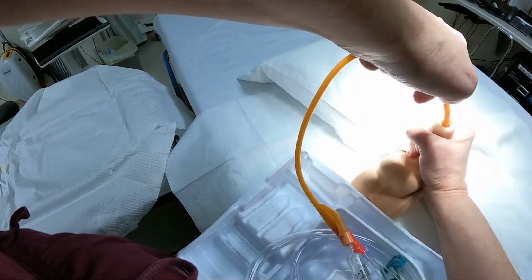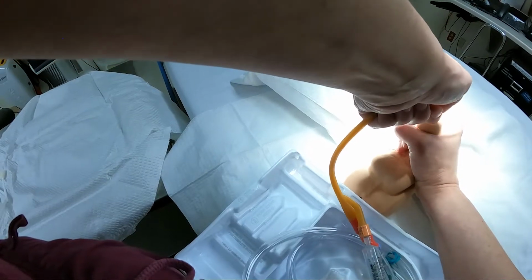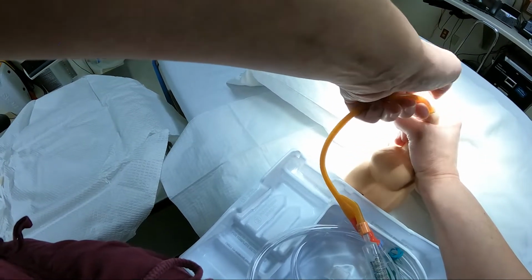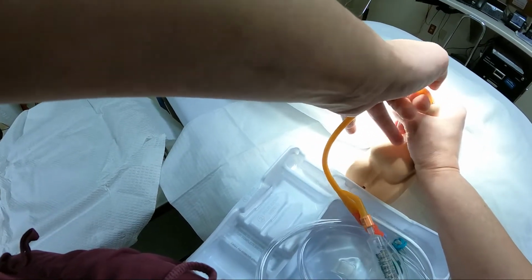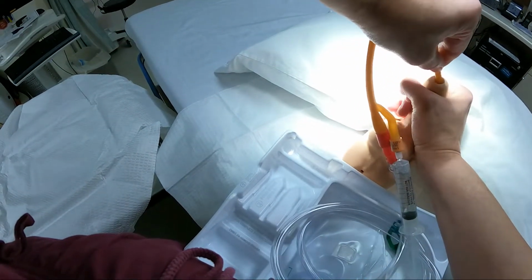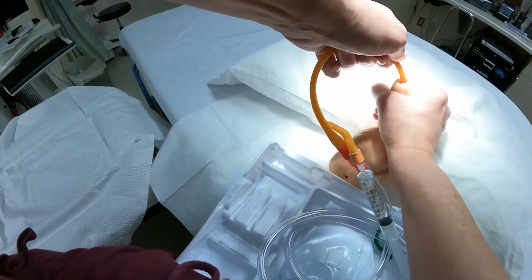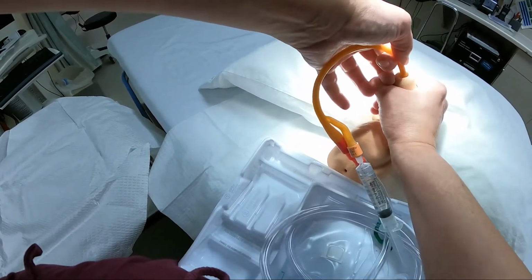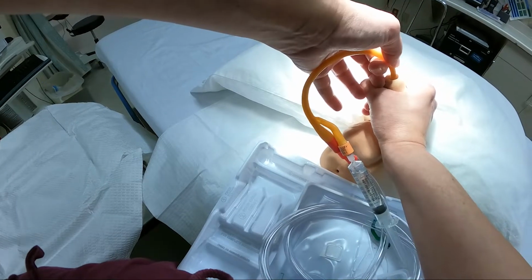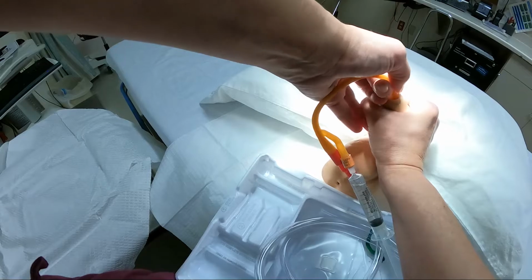Now with men especially, you need to go all the way to the bifurcation. So you have them breathe deep, lubricated well. Sometimes you got to pull up and hold pretty good traction. Now I've seen some urologists pull patients up off the bed via their manliness, but I don't suggest you try that. And if you meet resistance, just stop, pause, have them take some deep breaths, and try to relax and try to go through there.